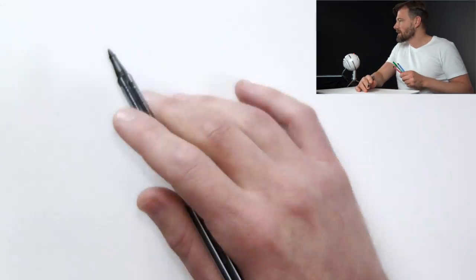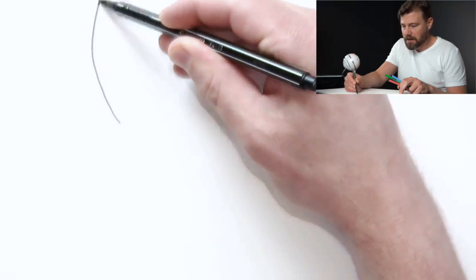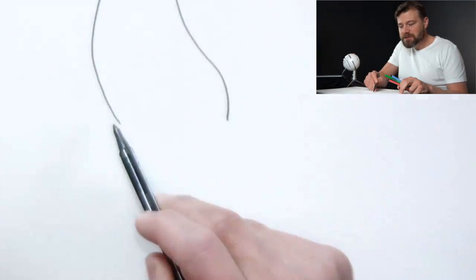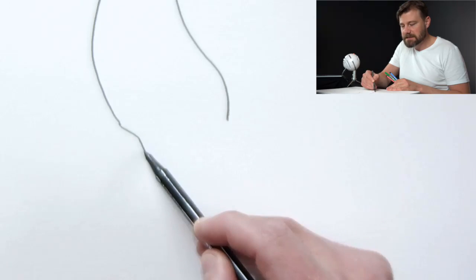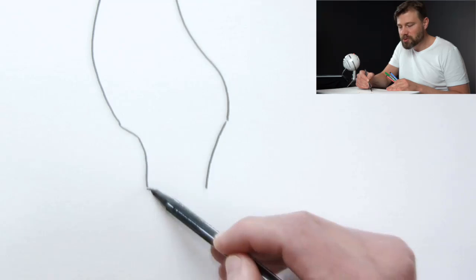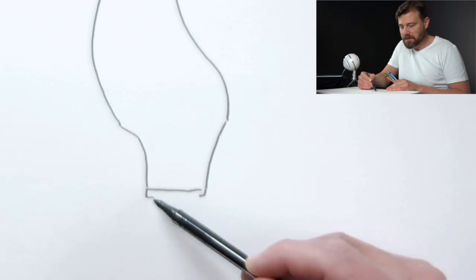When I face a case like this one, usually what we have is the crown here. When I reach the border of the soft tissue, this crown is going to have more or less this kind of contour, okay? It's supposed to be a concave contour until I get to the surface of this abutment, okay?